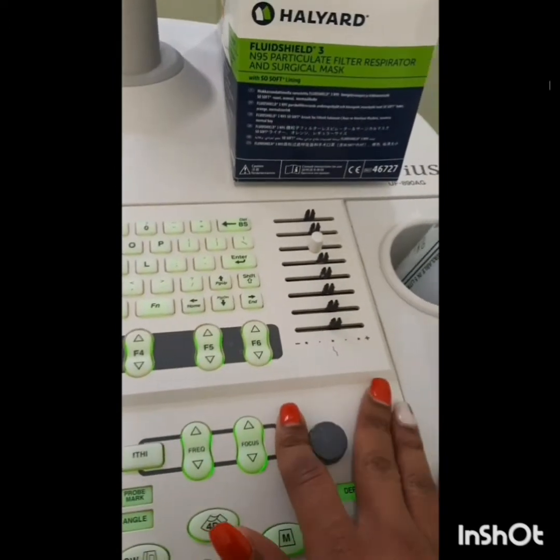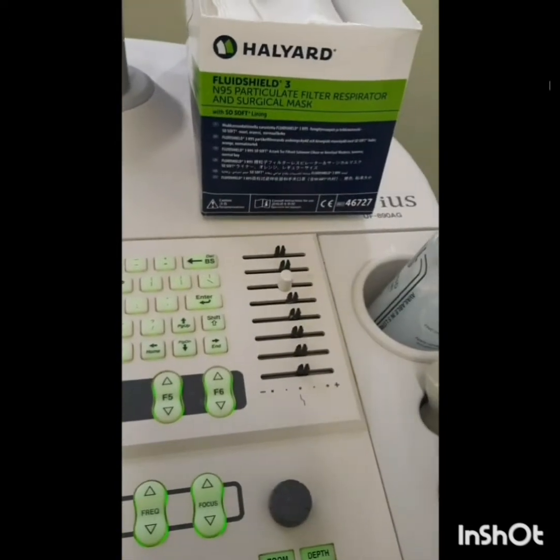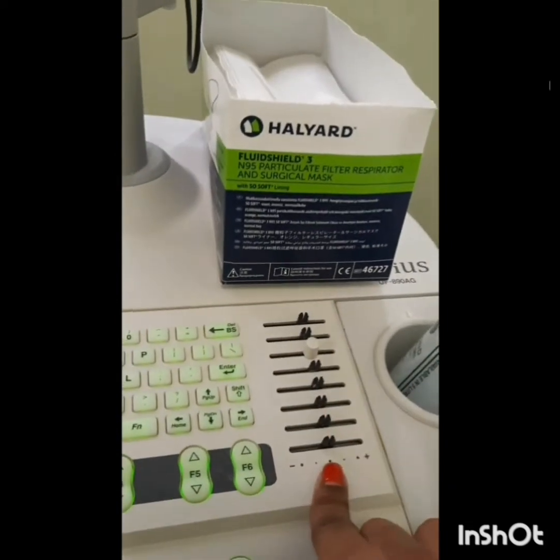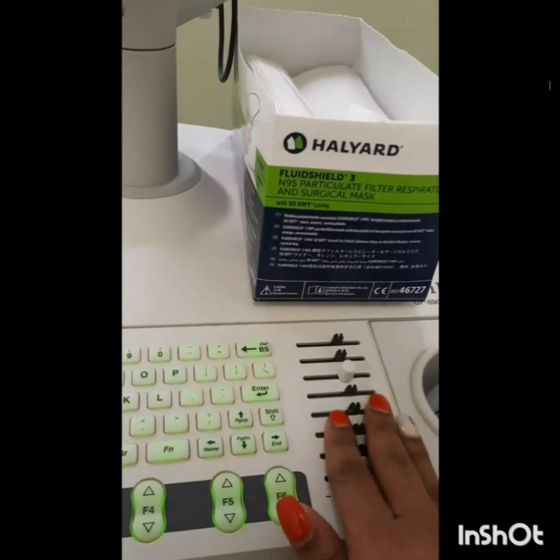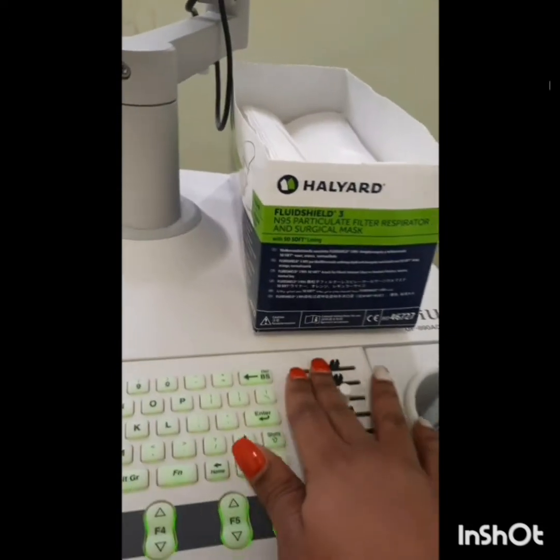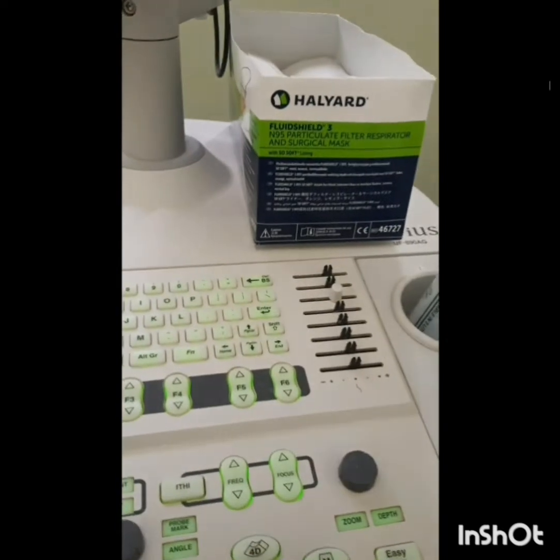And then these are the two most important buttons on the machine that you're going to use throughout your scan. The TGC is used to adjust the gain of the image. Depending on how your image is, you're going to adjust it according to the level of brightness or darkness you want your image to be.